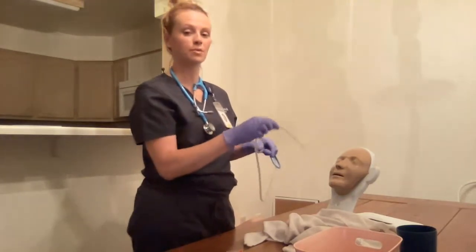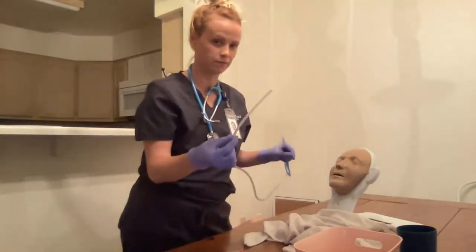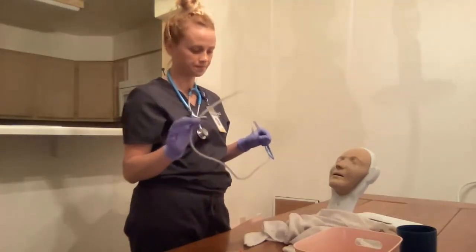When it travels down to the oropharynx, she's going to gag, and that's why I'm going to ask her to lean her head forward. I'm going to ask her to swallow, and each time she does so, I'm going to advance the tubing about 2 to 4 inches.